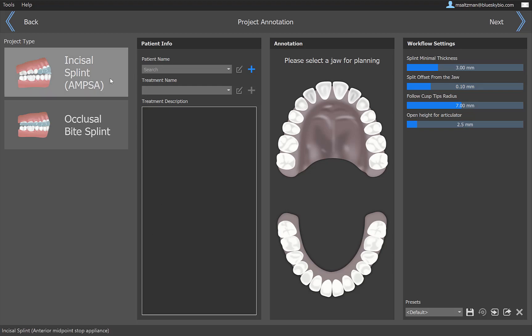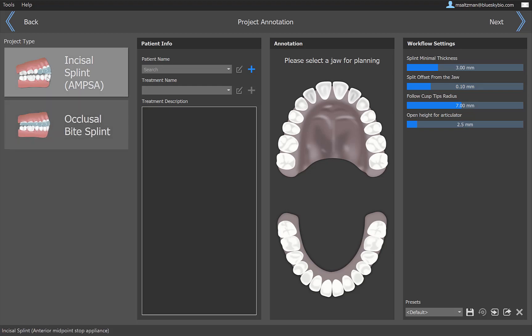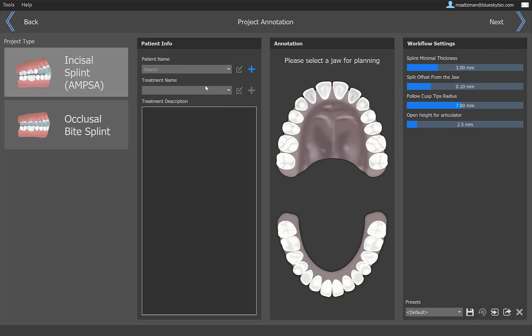Now we're at the start screen to design the splint. We have two process flows that currently exist. The main difference between the process flows is the first one includes an anterior deprogrammer, and we could see that in the little image that we have here, and the second one does not. So we're going to choose the process flow for the anterior deprogrammer. What we've also incorporated more and more throughout the Blue Sky Bio Digital products is the concept of patient and treatment. We want to keep the data organized by patients, so it'll be more organized for you in your Blue Sky Bio Digital account, and by the treatment.